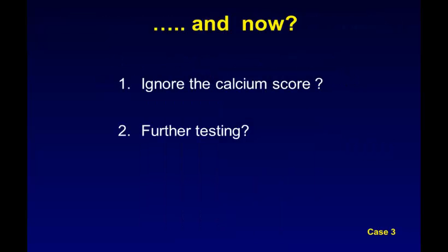Can we quickly retest here whether you now would ignore the calcium score, because there was no difference in outcome between those with and those without high calcium score, or whether you would do further testing?